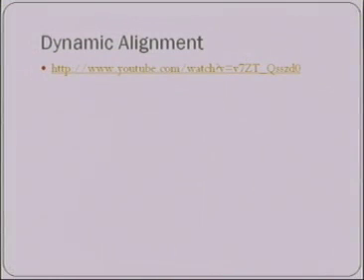Okay, so that video was over, it actually didn't show the bench alignment process, it just showed the dynamic alignment process and then the transfer, and then the patient in the end was walking on his definitive prosthesis. That was a little bit different because there's not a lot of components to that. It was what's called a monolithic design, so there wasn't a lot of components to be transferred. It was all built into one piece for the final or definitive prosthesis.